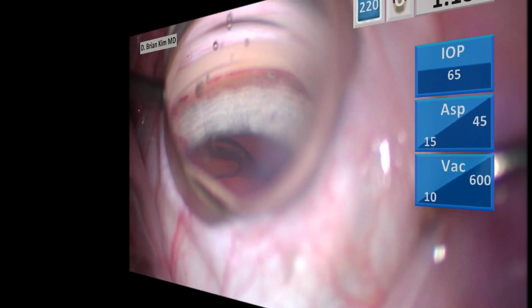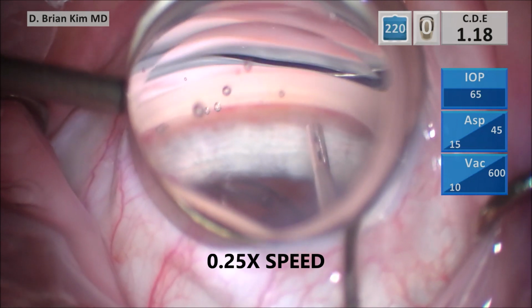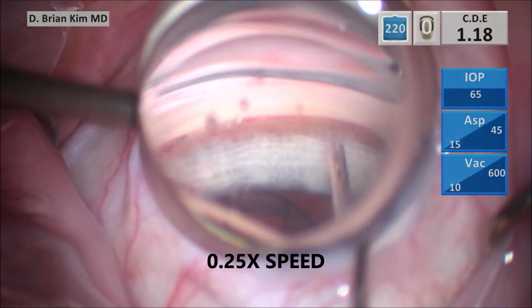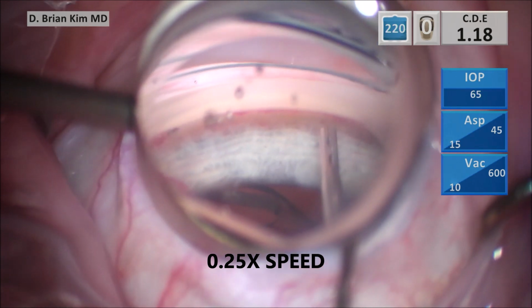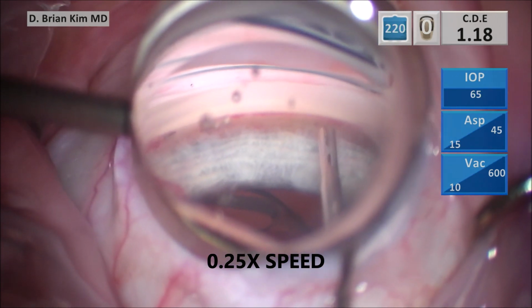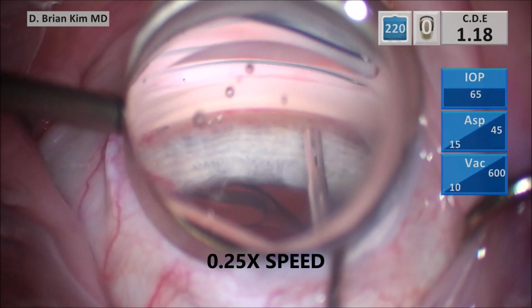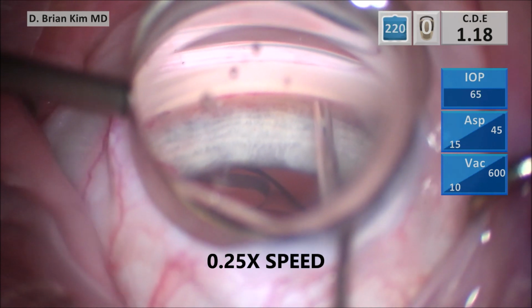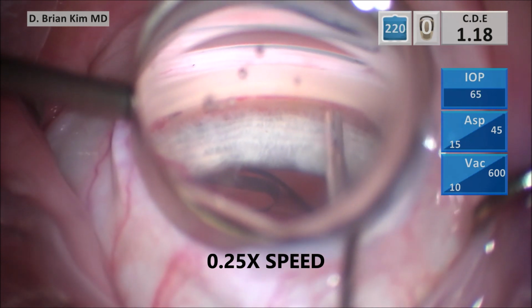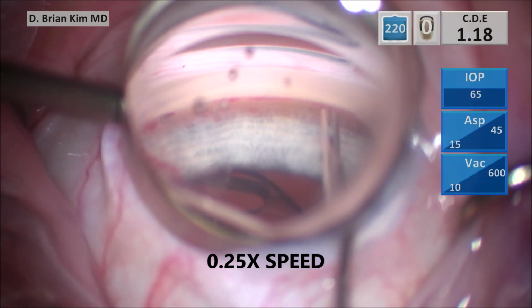I'm going to show this in quarter speed just to emphasize the movement. You can see here I'm just very gently rotating the device clockwise within the incision. By doing it that way, the tip of the device is going to be rotated more towards the right, away from the first stent. This will allow me to get it away from the first stent as well as achieve a more perpendicular approach to the trabecular meshwork.